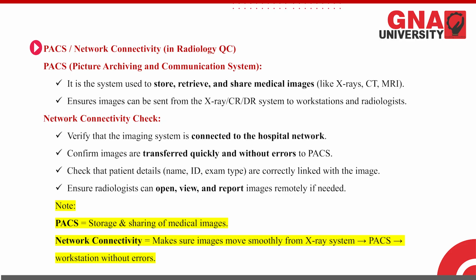And next is network connectivity checking. We have to verify that our imaging system is connected to the hospital network properly. That is, the RIS, the Radiology Information System, and the HIS, the Hospital Information System. We have to check that our imaging system is connected with these systems properly in order to store and retrieve the medical imaging data.